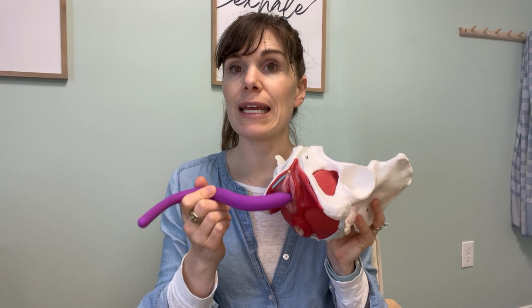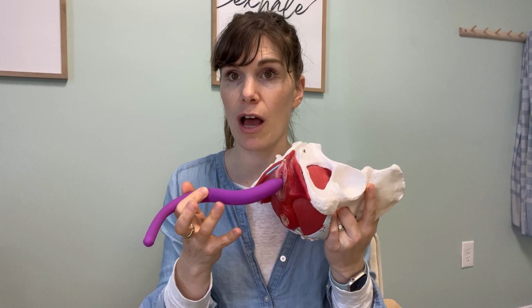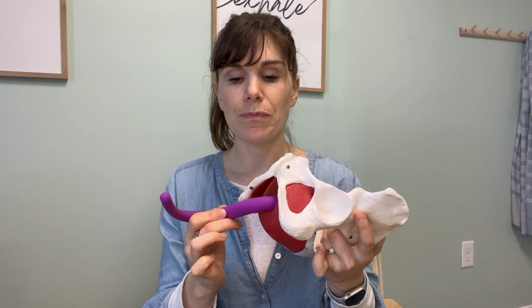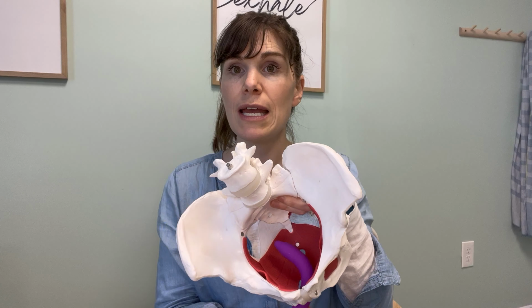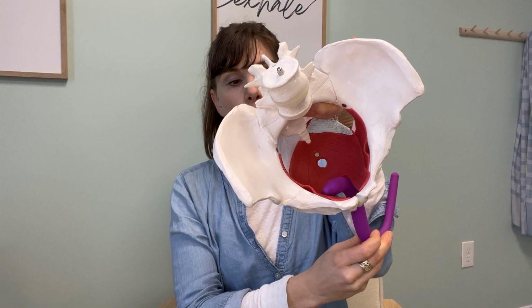Make sure that your body accepts and allows the insertion of this dilator without guarding. So once you feel comfortable with that, you are going to insert the dilator, always making sure that it is comfortable to you.